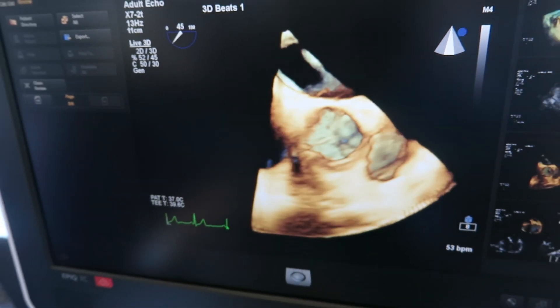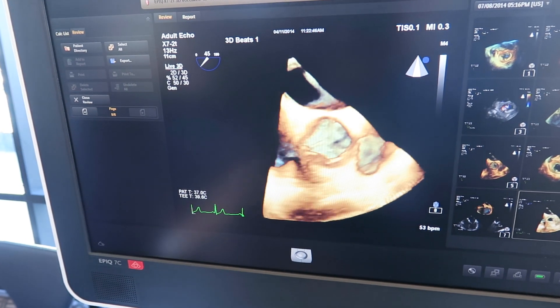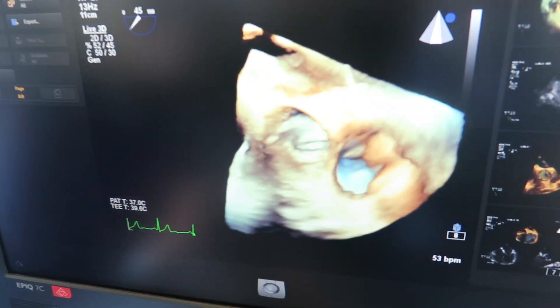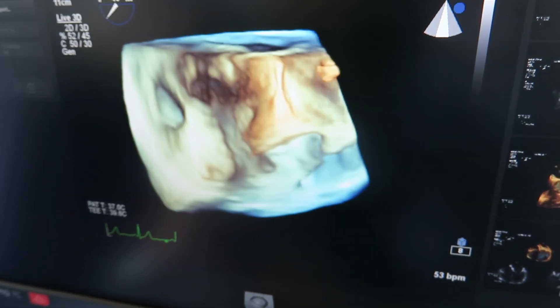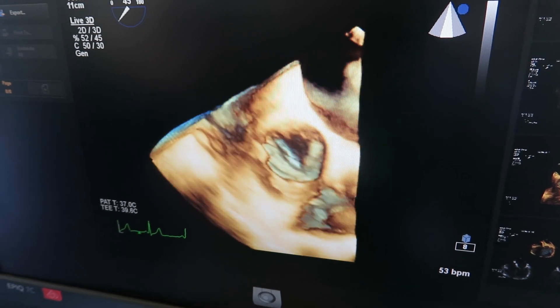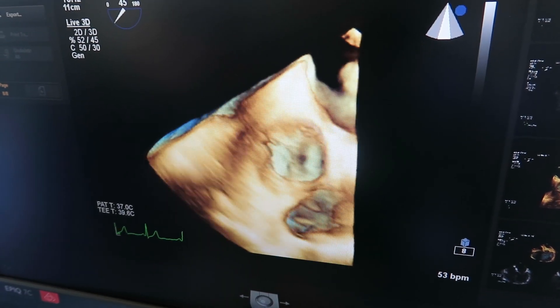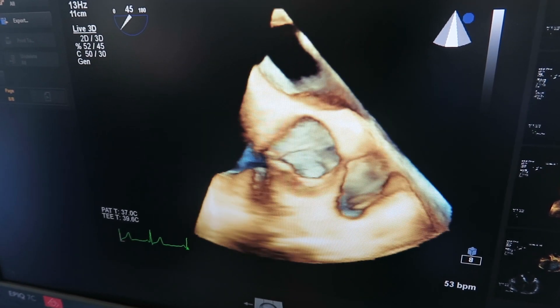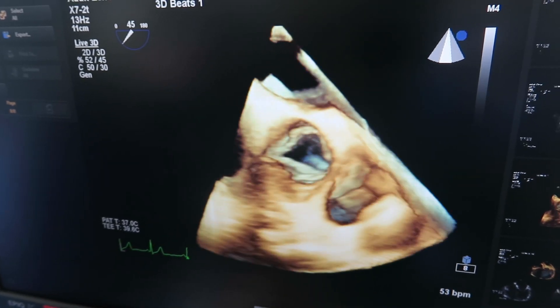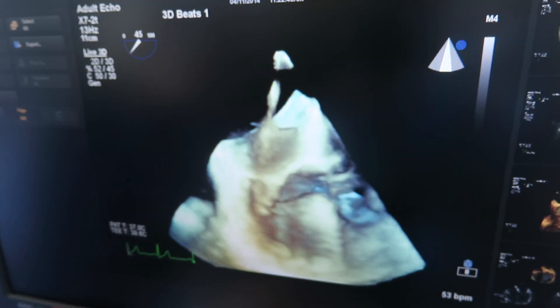By using this technology, we are able to see not only exquisite detail, but I can rotate this image around. I can see it from the front and the back.